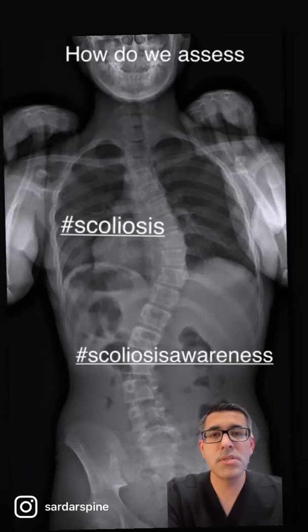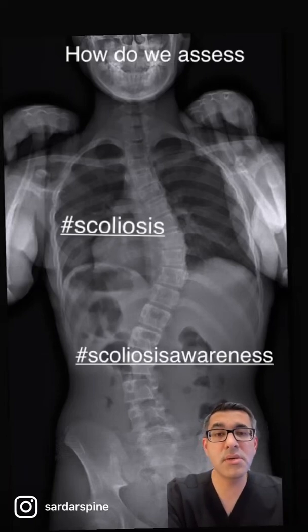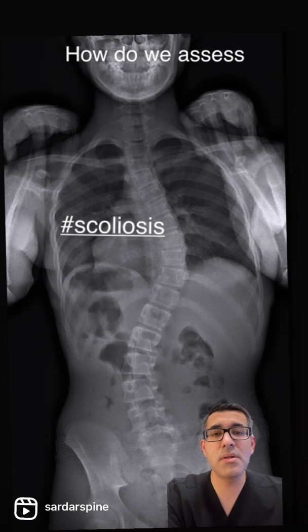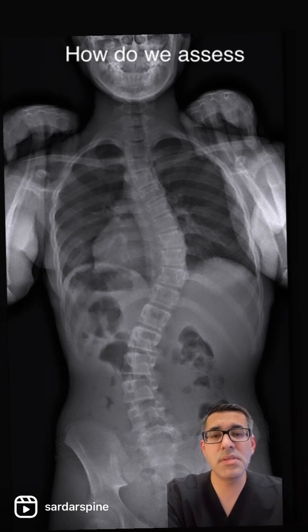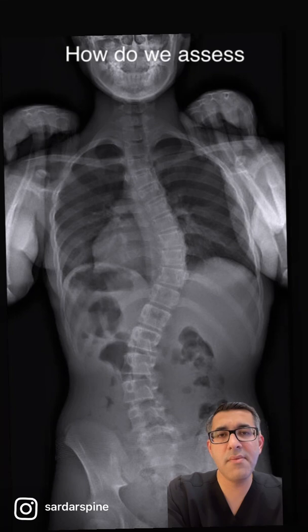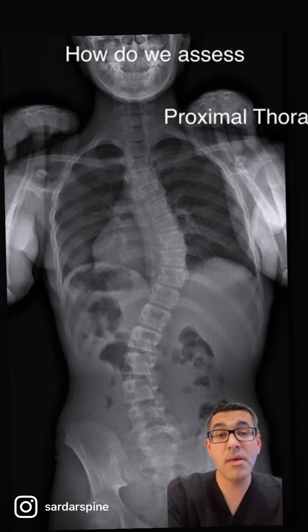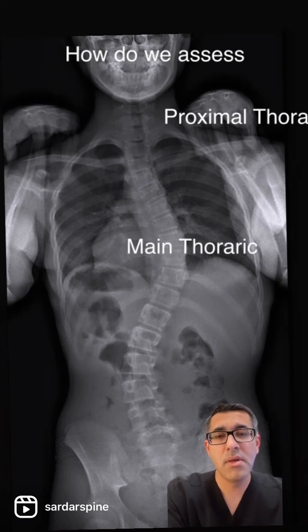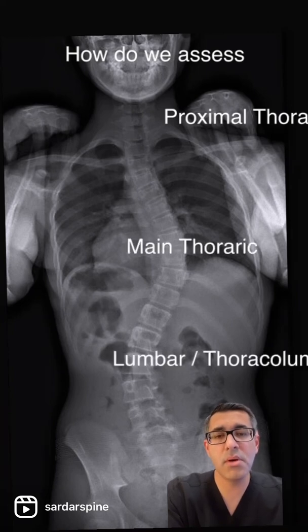We usually start assessment of the scoliosis X-rays by looking at the frontal plane first. Typically, in idiopathic scoliosis, patients will have three different types of curves: a proximal thoracic curve, a main thoracic curve, and a lumbar or thoracolumbar curve.